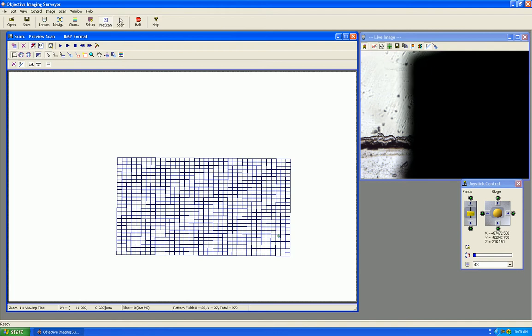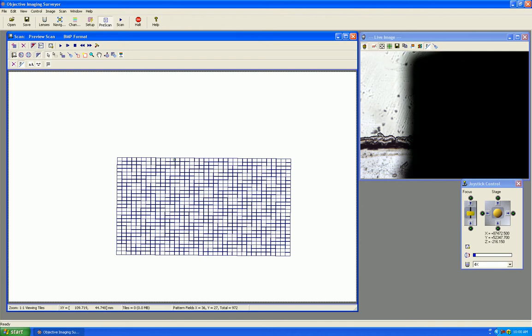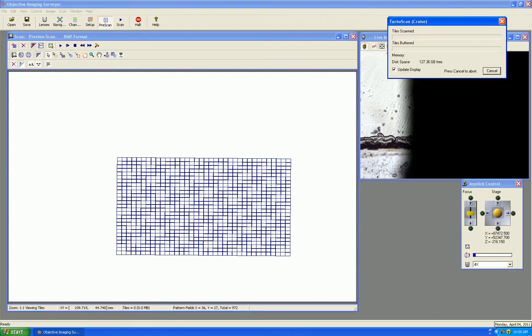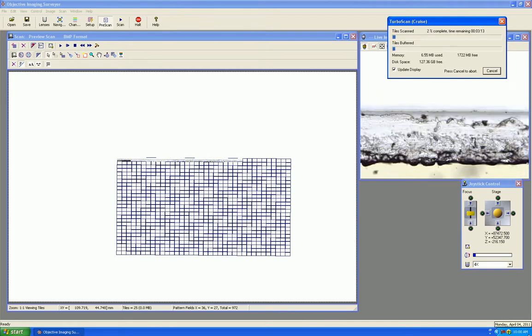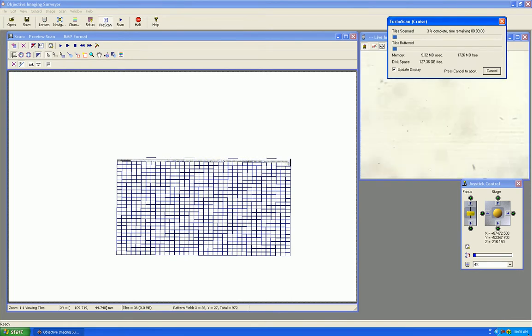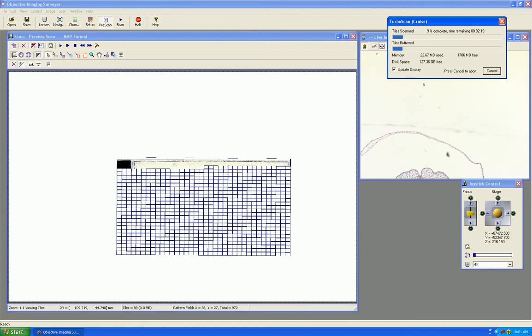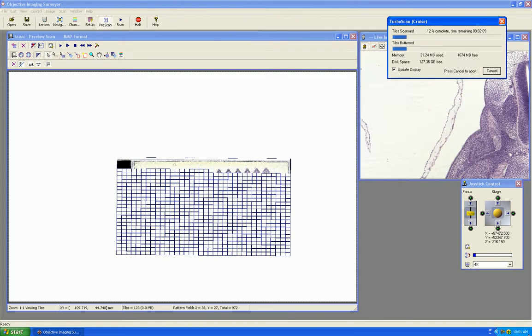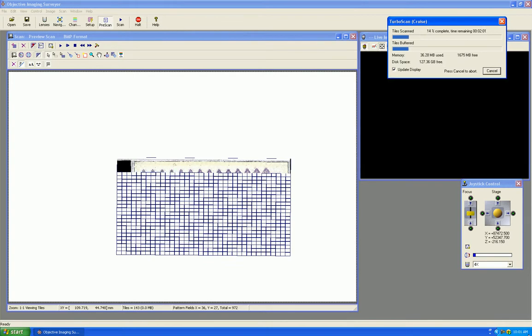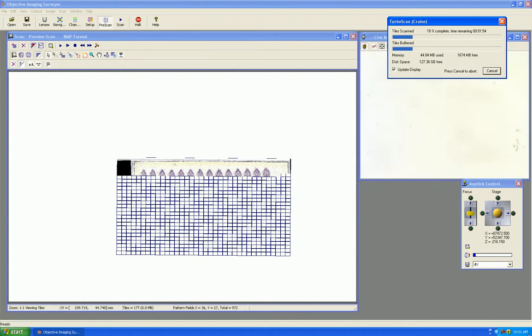Okay, I want to do an initial pre-scan and do it in the TurboScan cruise modes so I can see where my slide is. Once this is done, I'm going to then refine this pre-scan and rescan the slide and then save this pre-scan window so when we load future slides that have the same size and dimensions, we can rapidly find where our tissue is located and not have to repeat this process.